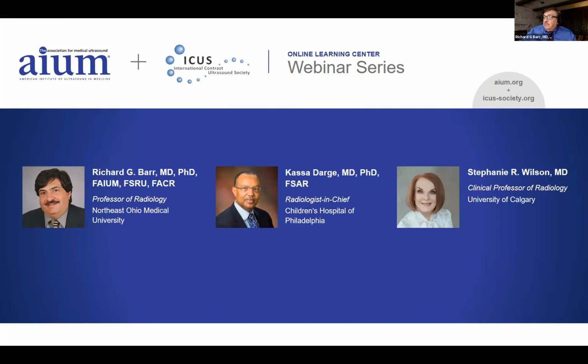Thank you, Richard. So Kassa, how about if you tell us about the Children's Hospital and what you do with your sonographers? So the Children's Hospital of Philadelphia is a dedicated standalone pediatric hospital. So we are a quite large radiology department. We have a whole ultrasound unit with some 15, 20 sonographers, and all of them are trained in contrast ultrasound. All of them are trained to inject contrast agents.